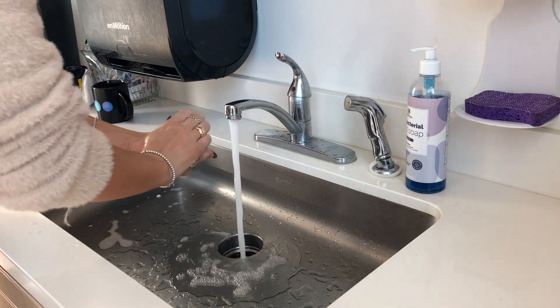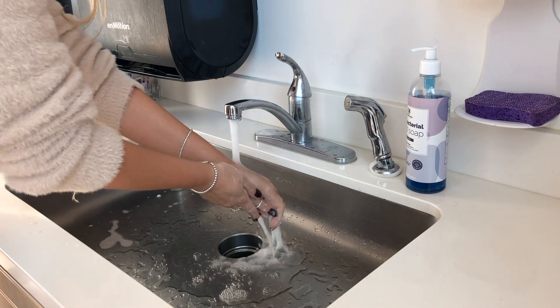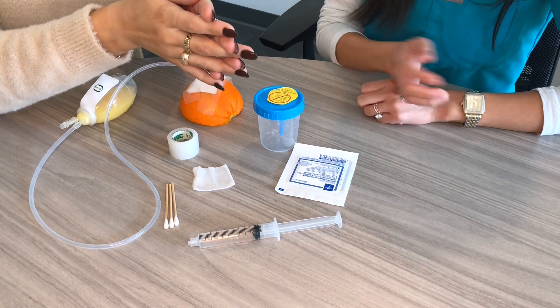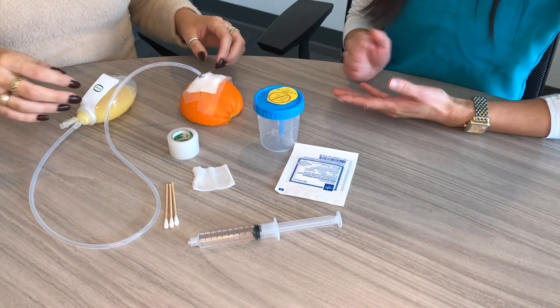First, you'll want to wash your hands with soap and water before touching the drain. You don't have to wear gloves, but you can if you want to. Now gather your supplies — they don't have to be sterile. Go ahead and remove the dressing.